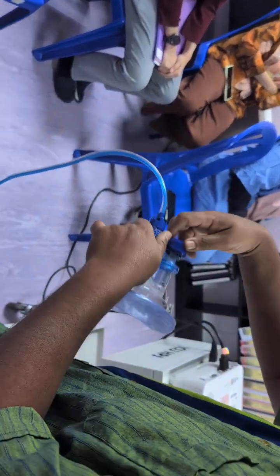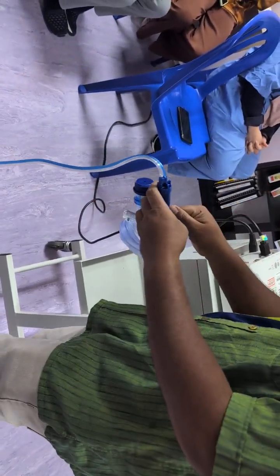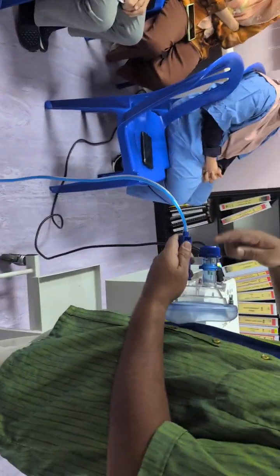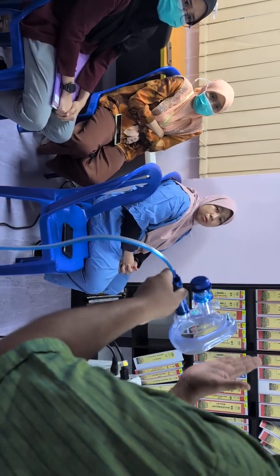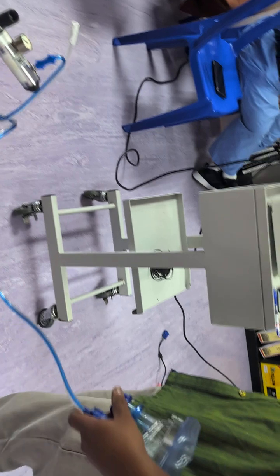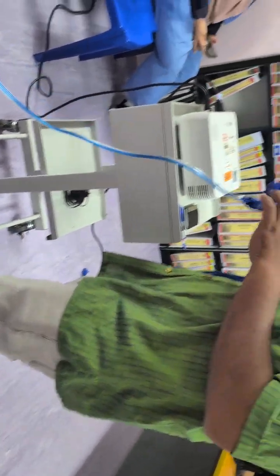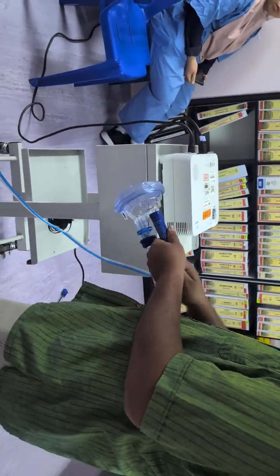If I want to increase, I increase, and when I pass it around later, you will see they tell you to increase the flow. When I increase the flow and I increase the mechanical PEEP, did the PEEP increase? So you know exactly what FiO2 you're giving and what PEEP you're giving to the patient. This is life made easy for everybody.